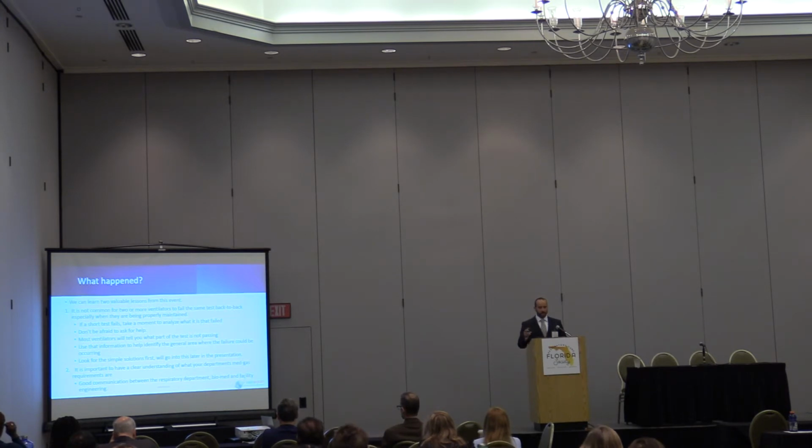So I'll go into those troubleshooting things a little bit later on in the presentation, but that's just something to be mindful of. And it emphasizes the second point of the importance, and especially now, in fact, we were speaking about this a little bit before coming up, is the importance to have clear communication between the respiratory department, your biomed, and your engineering, where everyone's aware of what your med gas requirements are and your limitations are as well. This way, avoid some unexpected problems should you get a spike, and you can react accordingly when the demand arises.